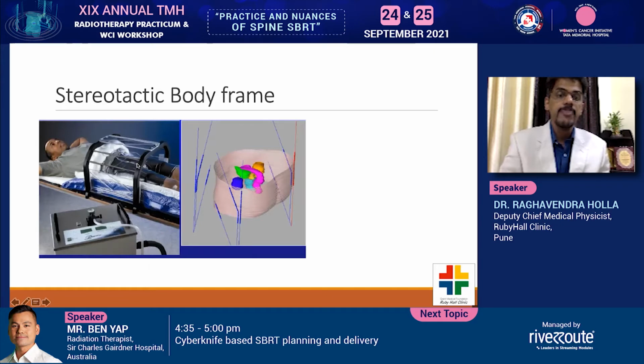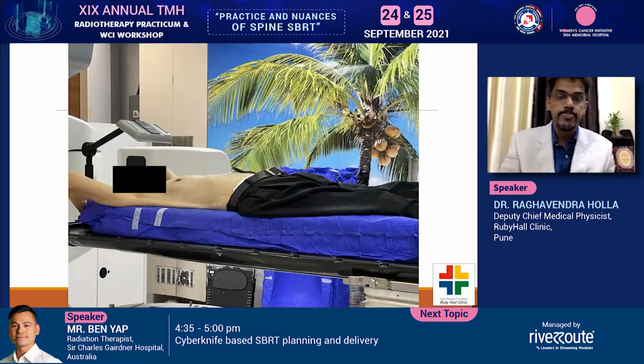So the difference will definitely show in the image itself, and adjusting the patient back to match either the anatomy or the fiducial markers is a question. That has to be validated in the center and checked again and again. There are a lot of issues involved, so we discontinued using this particular product in our center.